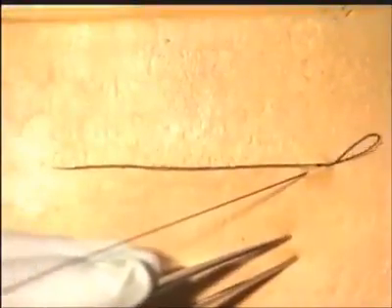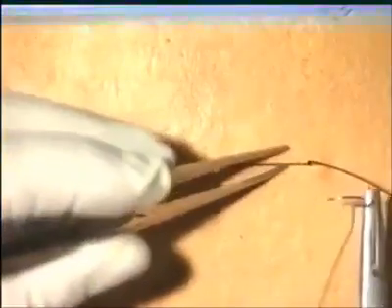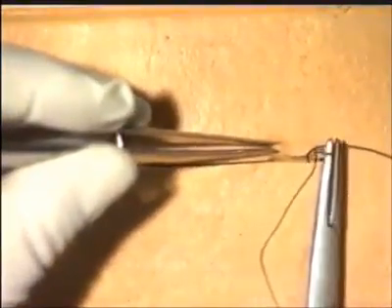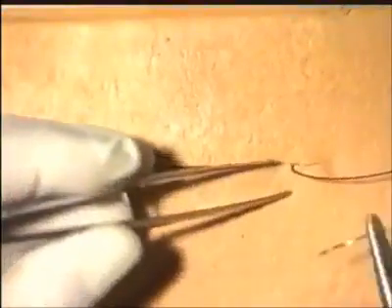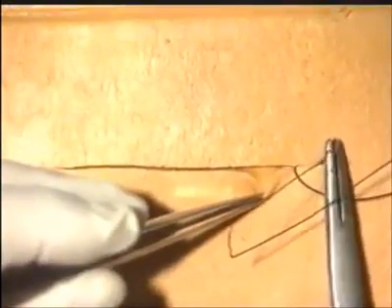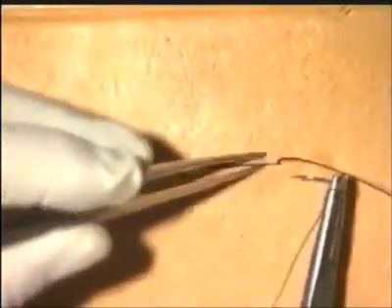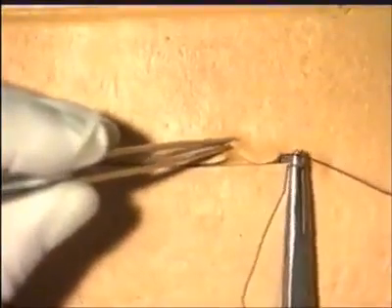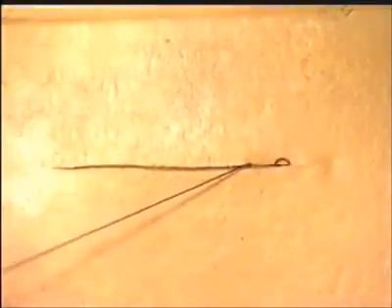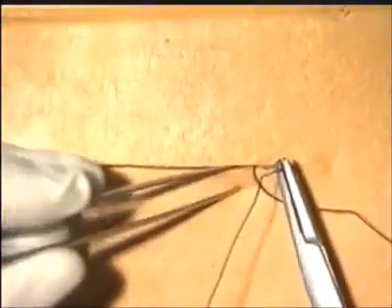Then, on the opposite side of the wound, insert a similar subcuticular bite of the suture material, and gently work up the wound, ensuring that each bite does not go too deep into the tissues. Each new suture must be inserted almost opposite the exit of the previous suture, and this ensures that, as the suture material is tightened, it draws the wound edges together, almost in the manner of invisible mending. The accuracy of the placement of the sutures will ensure an equal tension down the wound, and neatness of the closure.